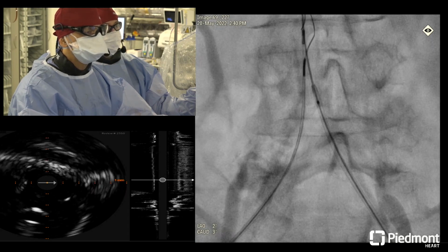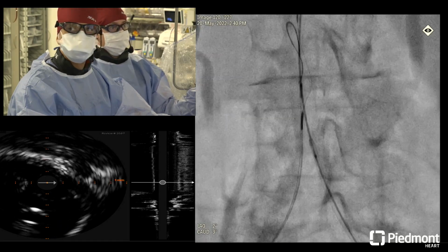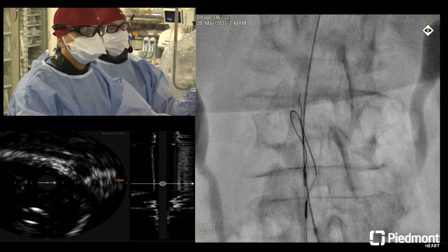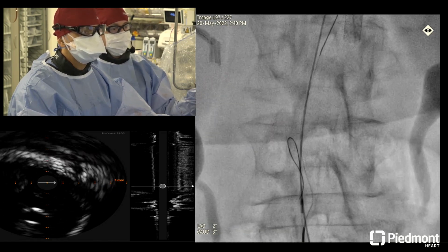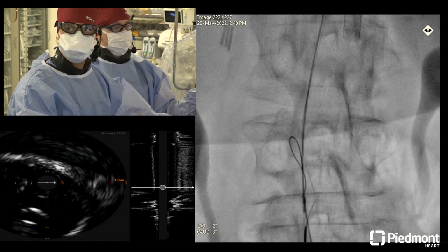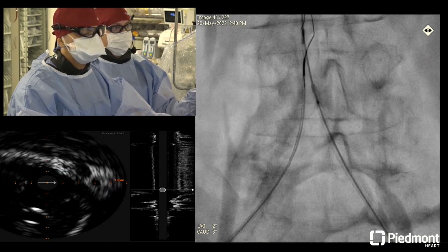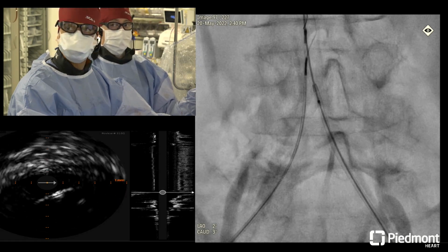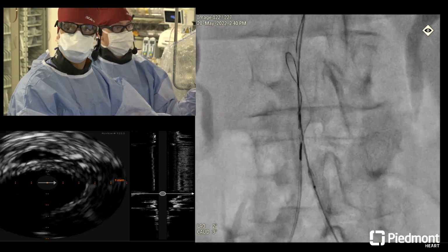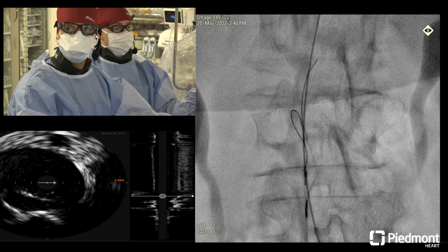That's it right there. I think the other important thing to be aware of here is those lumbar collaterals and the IMA. I believe both internals are out, certainly the one on the right, but the left I think is out too. If you disrupt any of that, it can lead to problems for the patient down the road. So being careful about re-entry here, not jeopardizing those, is exceptionally important. The other thing is the re-entry is now in the distal aorta, about 2 centimeters up from the bifurcation, eyeball-wise.